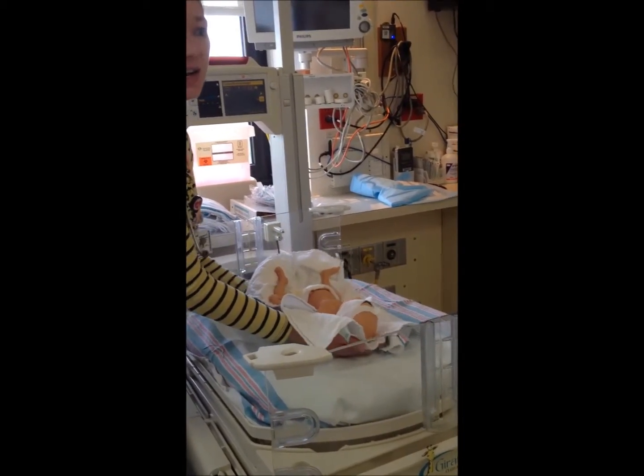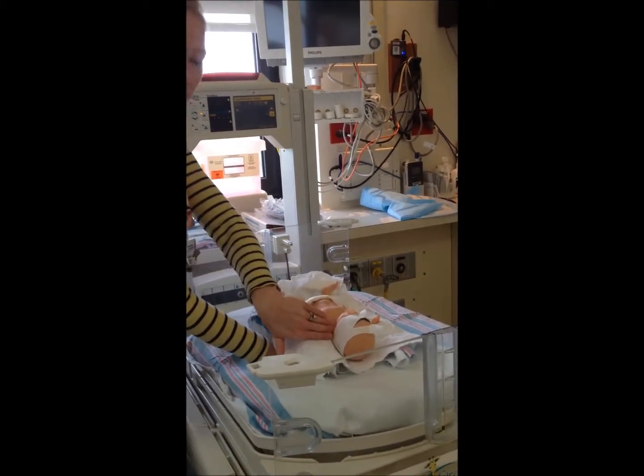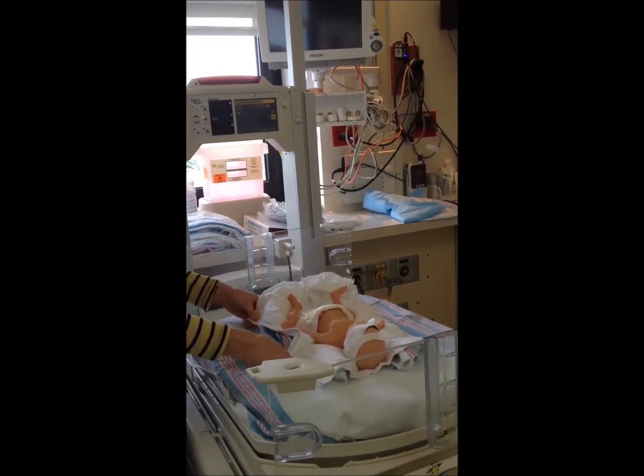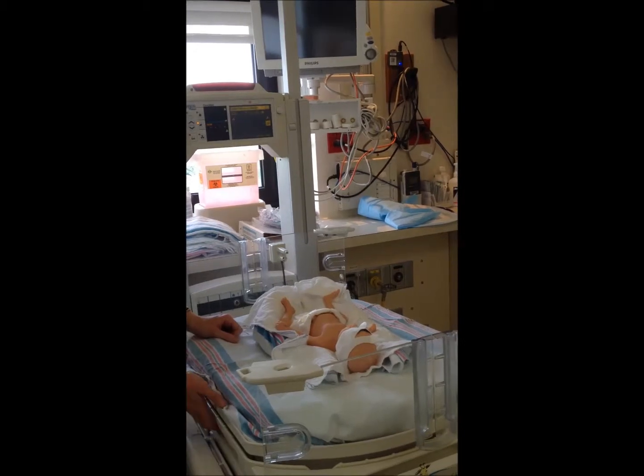It's a hard square piece of film, and oftentimes if we're doing their chest, it ends right where their little heads are, and there's a lot of sensory stuff that's very unpleasant for these little guys about that. So having the little drawers is really wonderful as well.